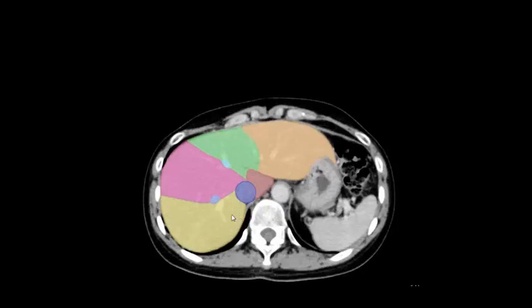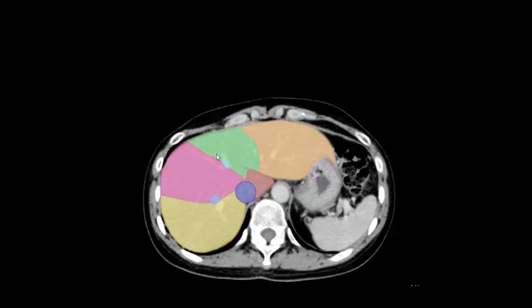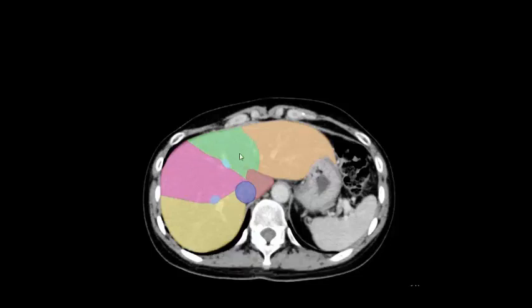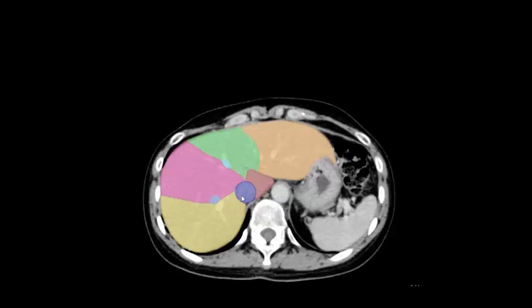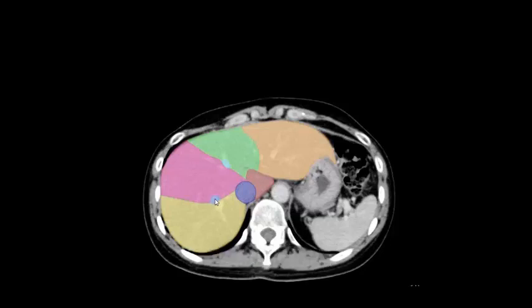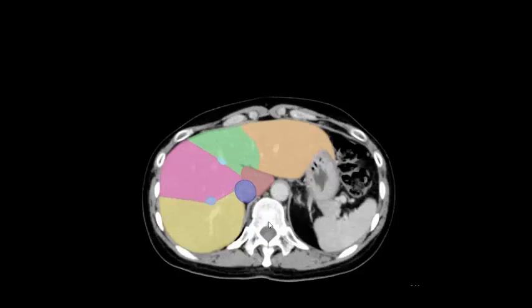Liver segment 8, liver segment 4a, liver segment 2, caudate lobe segment 1, inferior vena cava, right hepatic vein, middle hepatic vein.